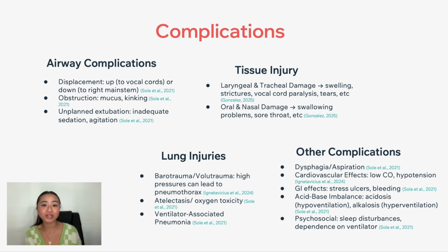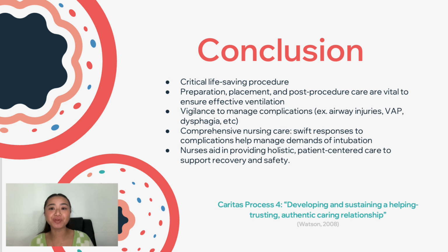And finally, the other complications to be aware of include dysphagia or aspiration, cardiovascular effects, GI issues, acid-base imbalances, and psychosocial effects. From preparation to placement to post-care, every single step is essential to ensure that the airway stays secure and the patient is ventilated and oxygenated effectively. By providing comprehensive care, we can balance holistic support, promoting recovery, safety, and patient advocacy.